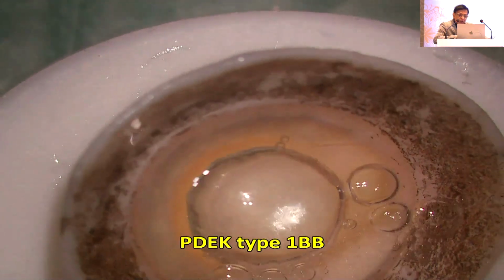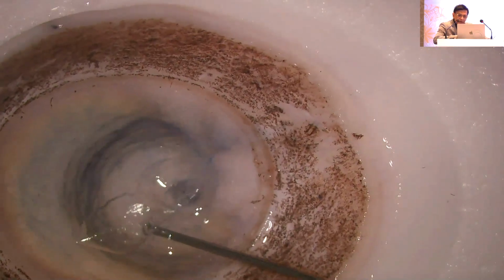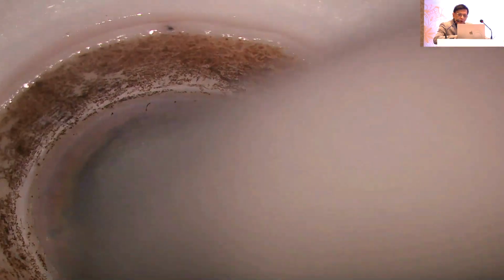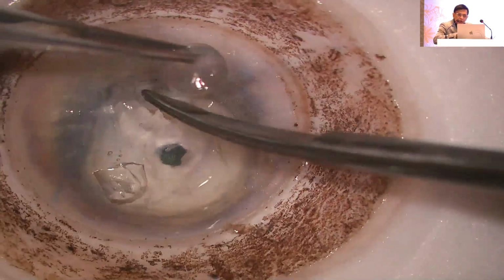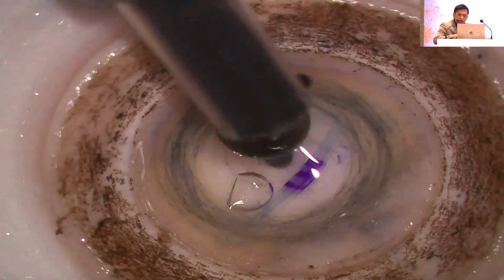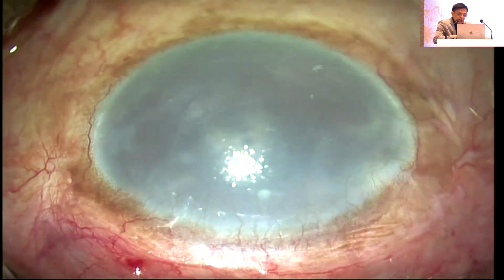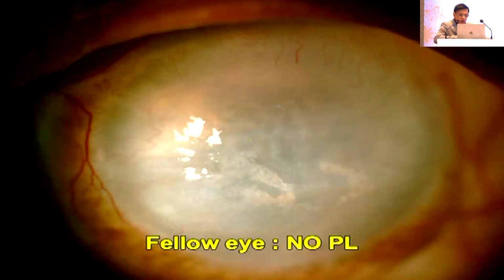If you want, another way to do it is, you made the bubble, cut it a little bit, flip it, you can make a hole in the center, now turn it upside down, so if you want to do a marking, S-shaped mark on the graft, you can do that also. Both ways are available.